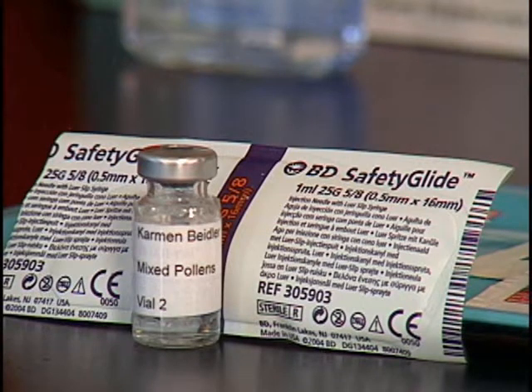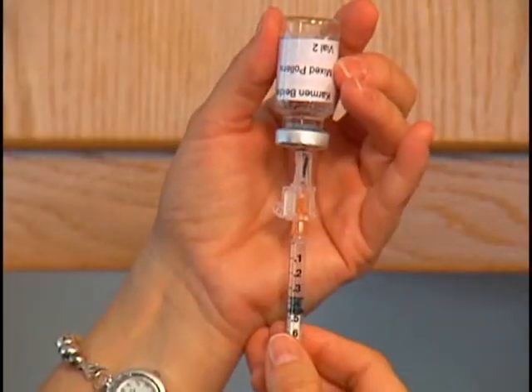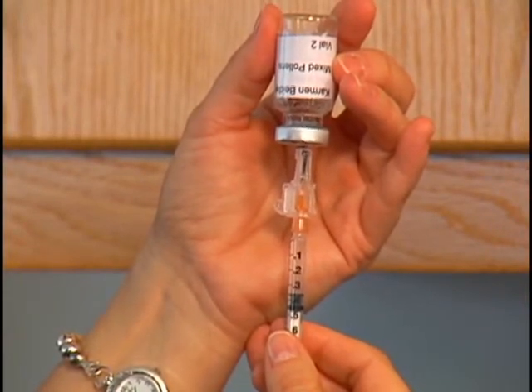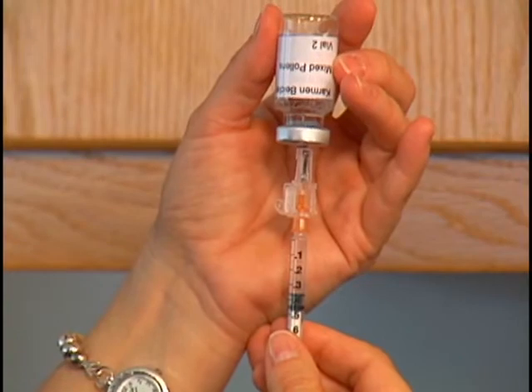Next, prepare the injection. To prepare an allergy injection, you will need the patient's allergy medication, a syringe with small calibrations known as a tuberculin syringe, a needle with a gauge falling between 23 and 25 and a length between 1/2 inch and 5/8 of an inch, and an antiseptic wipe. The patient must receive 0.35 cc's of her mixed pollens allergy medication today.